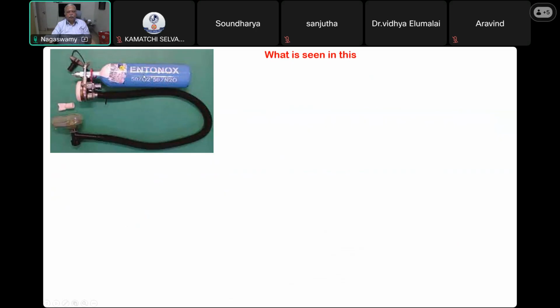Something like your numerology, when you write your name, when you want to write Rama, you can put R-A-M-A or R-A-A-M-A. Just like that, Ent is N2O, N2O oxygen. So that is the English alphabetical form of writing N2O, N2O, ox. Okay, so Entonox. Its cylinder dispensing unit.